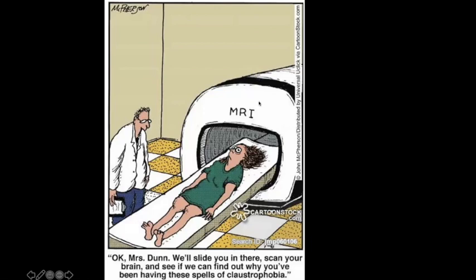I'm going to say yes, because I don't see anything else. But nonetheless, for things like surface area measurements and cortical thickness, you typically use the native space values, even if you map them into a common space. So you don't alter the values based on the mapping, you use the native space values, and you do a matching based on the sulcal anatomy in those cases.